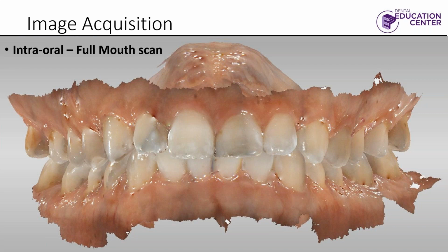But with using an intraoral scanner, we were able to go in and pull out his scans from when we made the sleep appliance and have the new restoration made to match the shape of the tooth as it was previously, bond that in, and the sleep appliance still fits like it did a week before he broke his tooth. Wow.